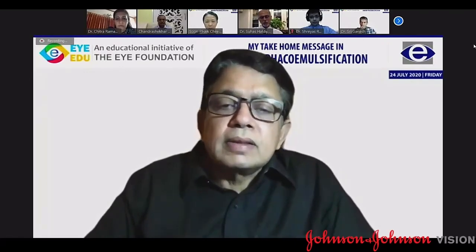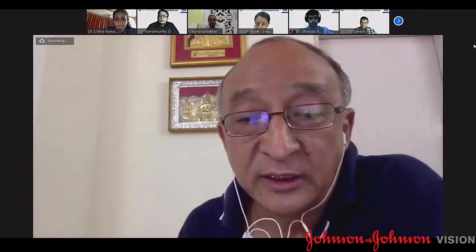Any of the panelists? I just want to add some points, because Dr. Wavikar had given very nice take-home points, and Professor Chi has covered almost everything. One point: whenever we do biometry, it should be done for both eyes. If the patient's other eye also has a cataract or even a pseudophakia, you should do both eyes, because sometimes it can give you a lot of information about each eye. The difference in axial length and the difference in keratometric values will make you think about extra things. So that is also important. Don't ignore the other eye in these cases.